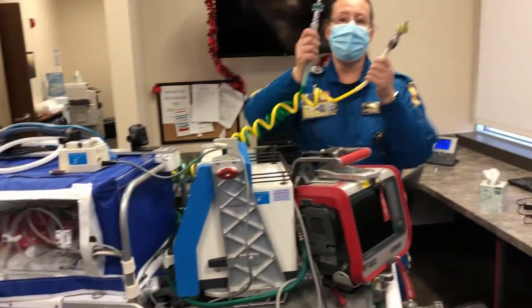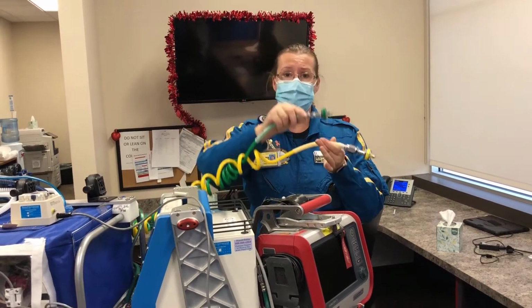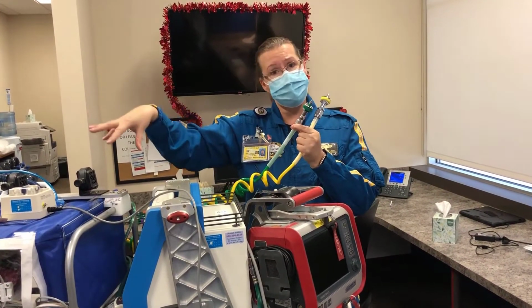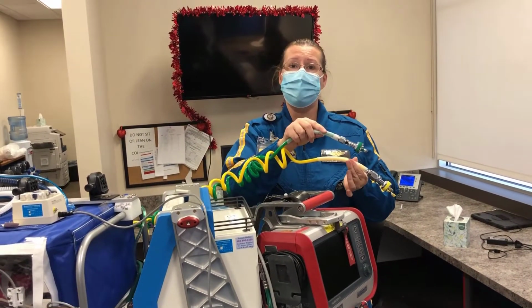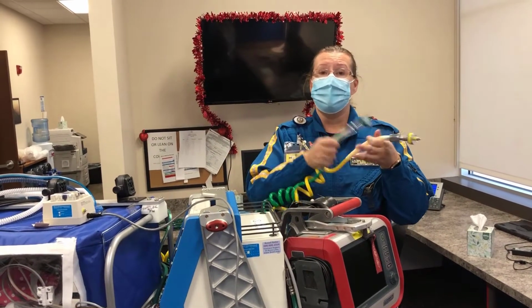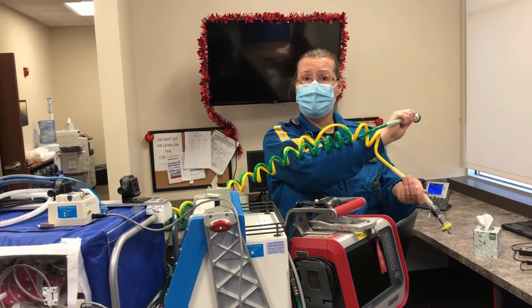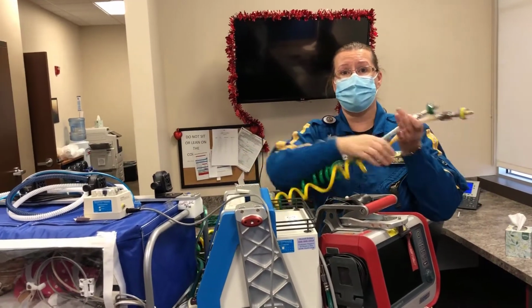When you are running off tanks, you need to have both the oxygen and the air connected, even though you're not using the air, otherwise the blender will make that obnoxious noise. So remember to plug both in just to give you that equal pressure and stop the noise on that. Once you get back to the aircraft, then you can just plug the one cord into the aircraft and every ventilator device is powered through the one cord.